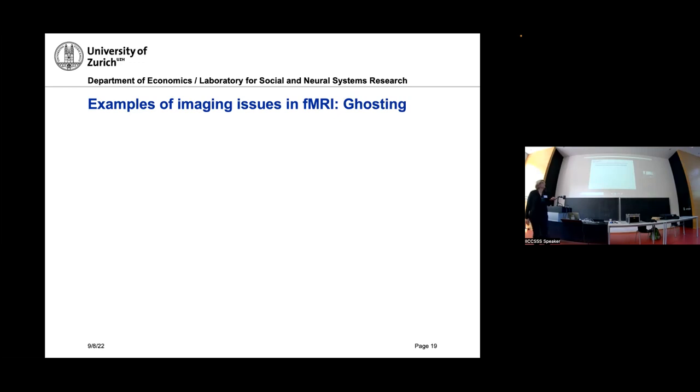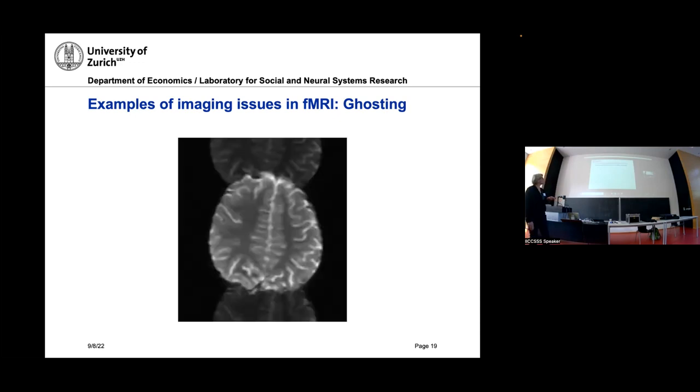The second one that always looks funny, and you wonder why this can happen, is again hard to see here. I hope it's better on the screen. Here you have the brain data, but what you see is half of the brain here and half of the brain here. And it happens a lot, and it's quite easy to happen. When you acquire your data, you have a slice package. I'll demonstrate here. At the scanner, you have a box that you place where your data is.